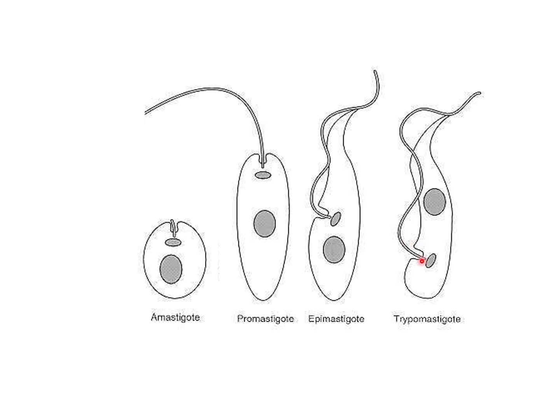it to the nucleus. For trypomastigote stages, the difference with promastigotes and epimastigotes is that the flagellum is all over the surface of the stage, and this flagellum is always close to the kinetoplast as in all of the other stages. However, the difference between trypomastigotes and the others is that this kinetoplast occupies a posterior position if we compare it to the nucleus. So, as a summary, amastigotes lack flagella. Promastigotes have a protruding flagellum from one side of the stage.